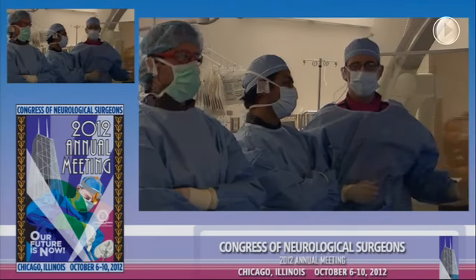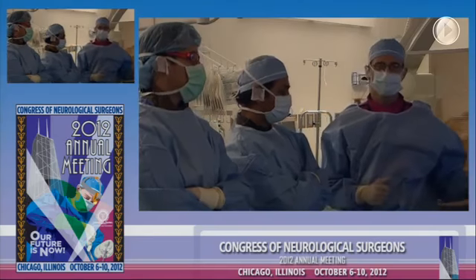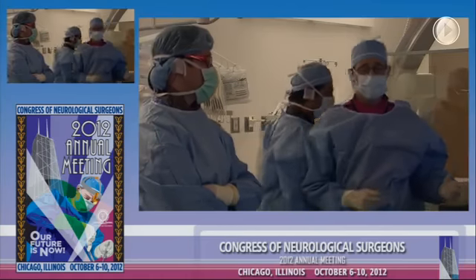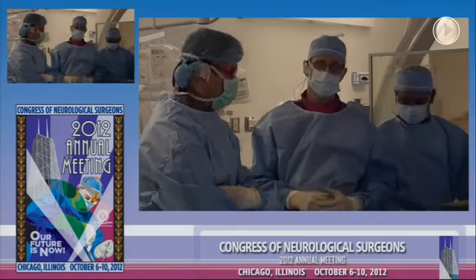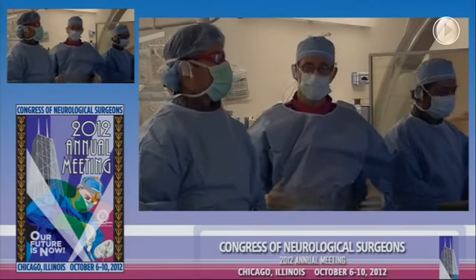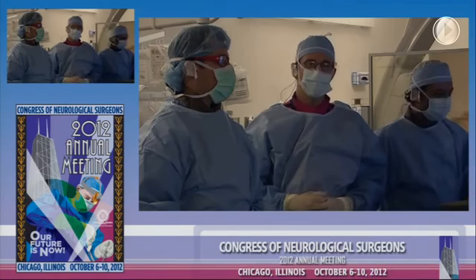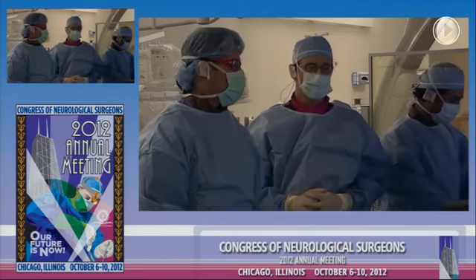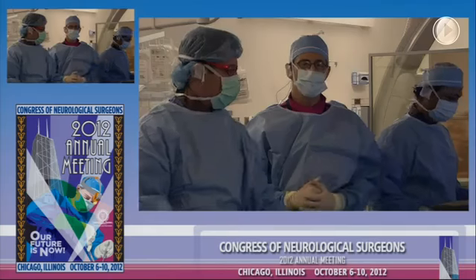Are these fraught with complications? Absolutely. Nick showed a slide in the beginning showing about a 6% complication rate. In the posterior circulation, when we ventured in beyond the VB junction, complication rates have been prohibitive. But for the right patient with the right anatomy, I think it's a very safe procedure, and I feel that it's really a game changer.